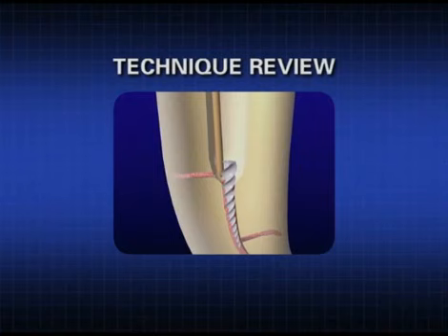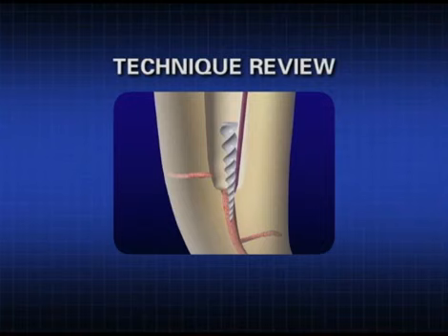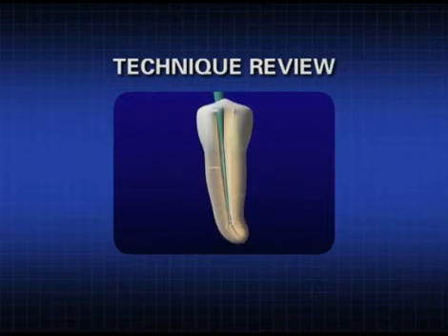Move in a counterclockwise direction and precisely sand away dentin to progressively expose the coronalmost aspect of the broken file. Depending on the root's dimensions and the depth of an external concavity, a longer length and smaller diameter titanium instrument may be utilized to safely conserve dentin and successfully displace the broken instrument. As a reminder, the final preparation should be no larger than it would have been if there was no broken instrument. Sometimes, however, ultrasonic trefining procedures prove unsuccessful.